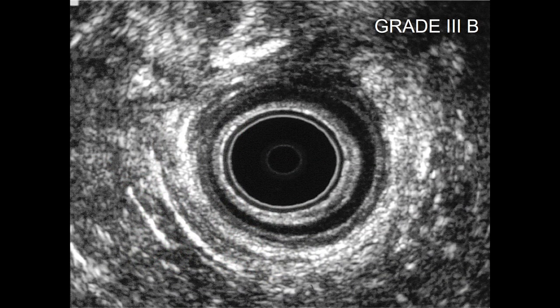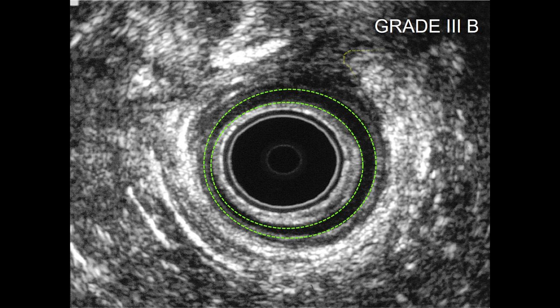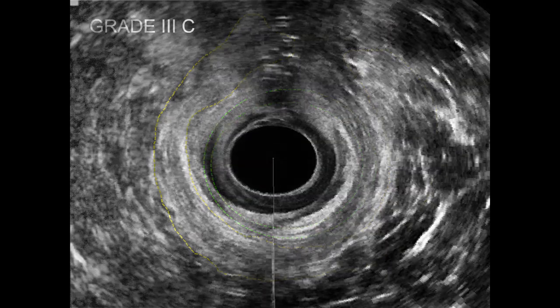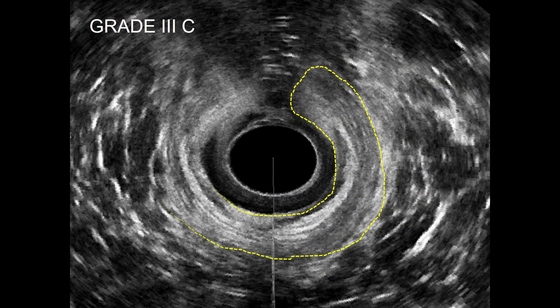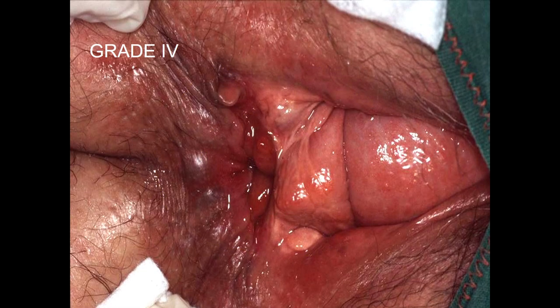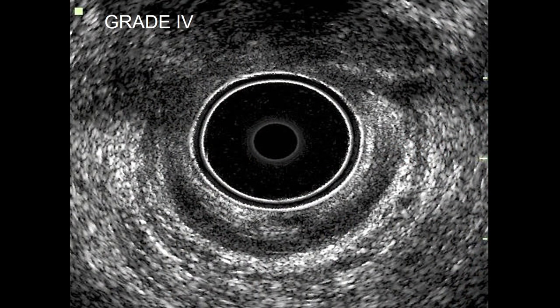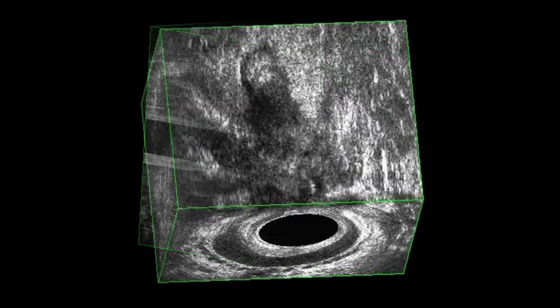Vaginal delivery can cause injuries defined as OASIS — obstetric anal sphincter injuries. We have four degrees; degrees three and four involve the anal sphincter. A typical 3B lesion: the internal sphincter is regular but the external sphincter is broken. 3C involves damage to both internal and external sphincter. Grade four means communication between the anal canal and the vaginal canal — the sphincter is completely missing anteriorly in the anterior half of the anal canal. This is the reconstruction with 3D.